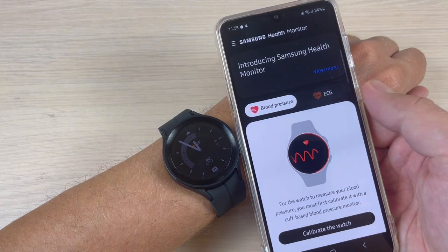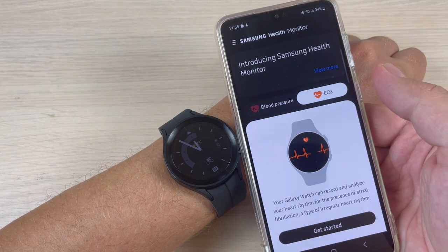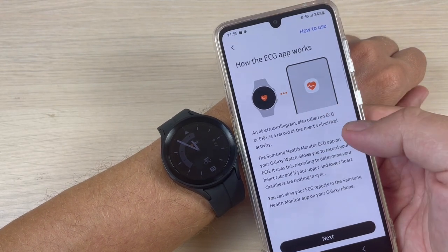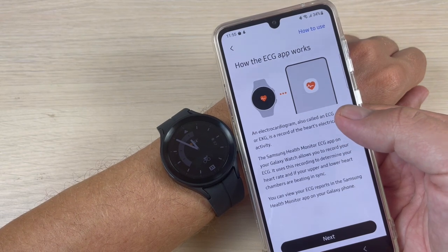Okay, and now because I want to measure ECG, just press on this and press 'Get Started'. How the ECG app works: ECG is a record of your heart's electrical activity.